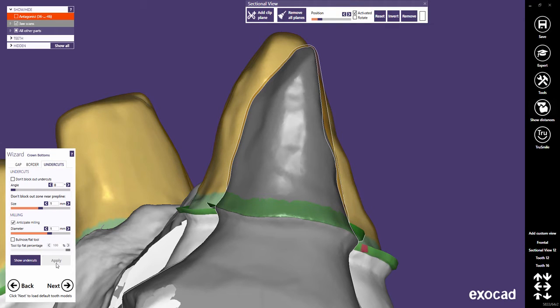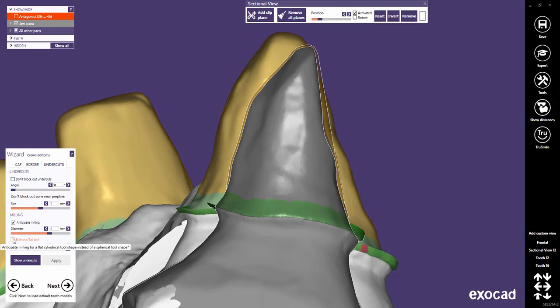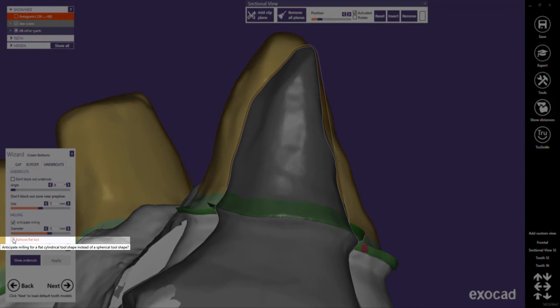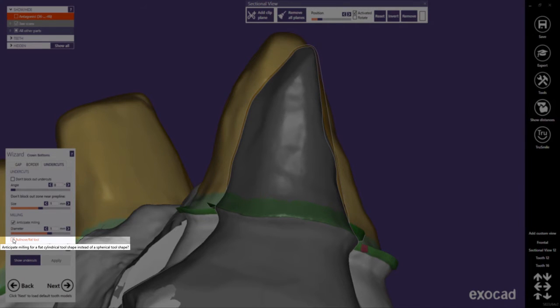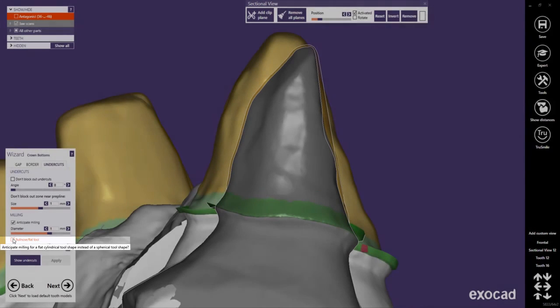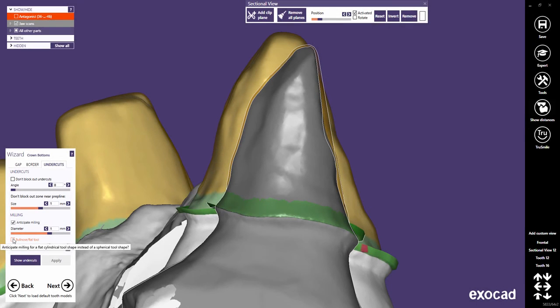The Bullnose Flat Tool checkbox enables a tool compensation for flat cylindrical tools instead of a spherical tool shape.